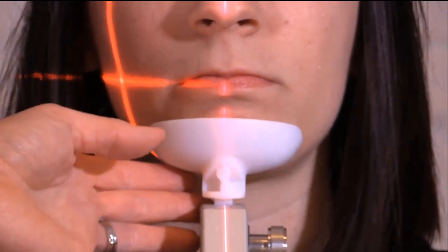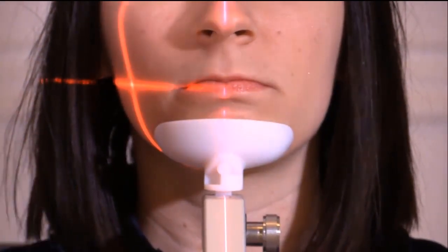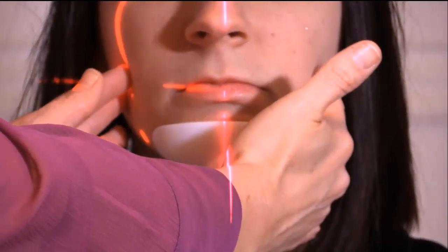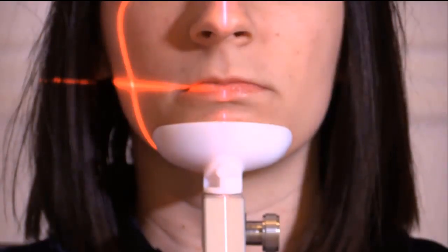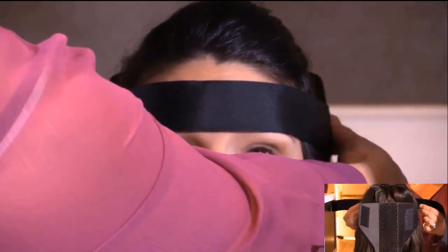We're going to look for the mid-sagittal line and want to line it up in the center of the face, typically going by the philtrum or ANS — the anterior nasal spine. I'm going to rotate her head slightly. We want to stabilize and use a head strap — it's going to come right across the patient's forehead, with two pieces of Velcro on the back of the headrest to stabilize them.